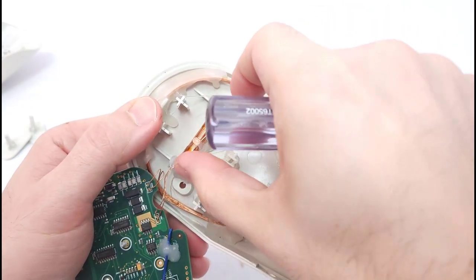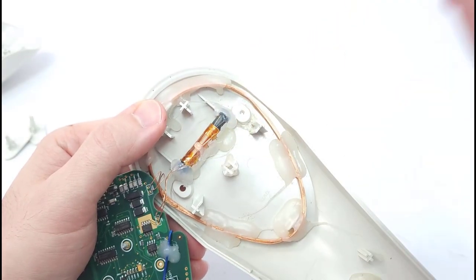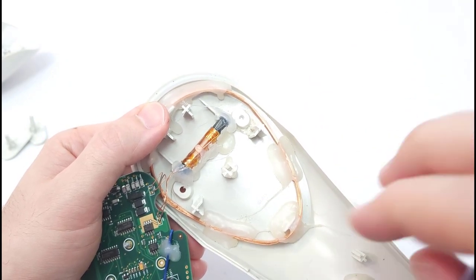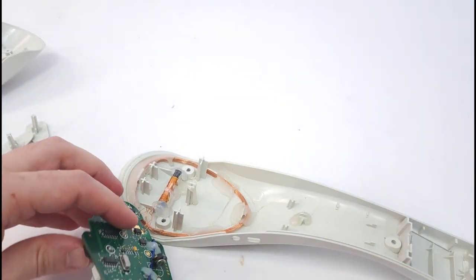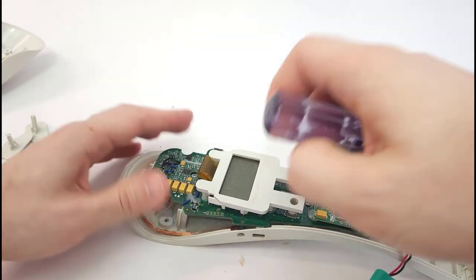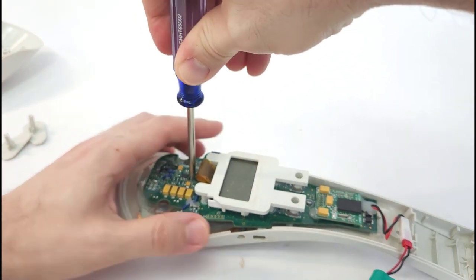So I just popped that back into place and applied a more liberal amount of glue, but being sure not to cover up the screw holes accidentally, because you're going to need those later when you put it back together. Then once that glue has dried, again making sure I did not use too much, because you want to make sure everything goes back together nicely. If you use too much, you might have trouble getting the screws back in.